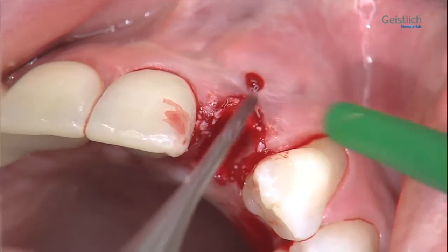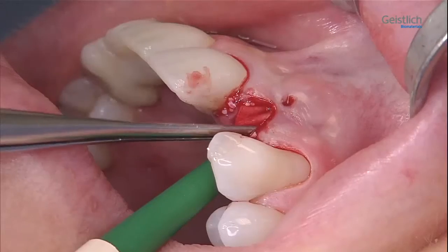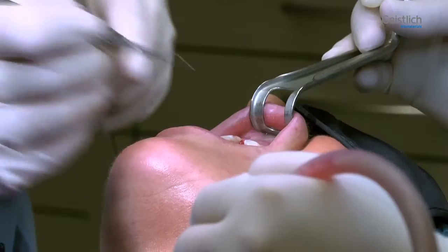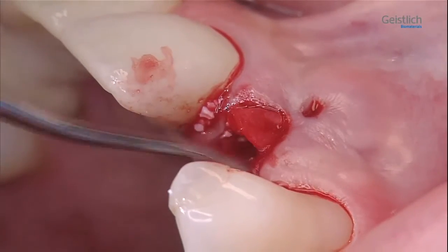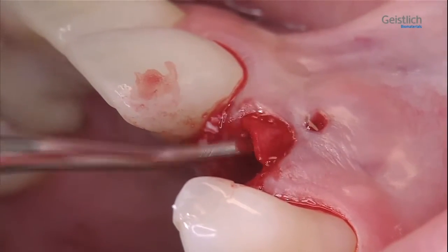We introduce the block a bit at a time, carefully condensing each portion as we go along. We remember to check the collagen membrane for correct positioning, adjusting it if required, so that the bone defect and socket will seal well.